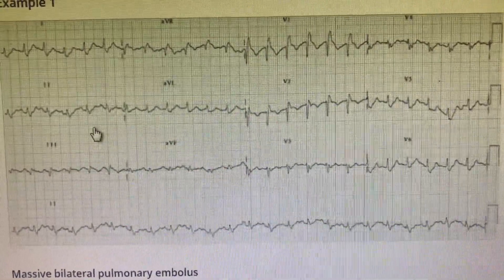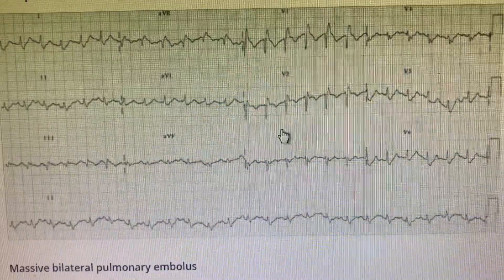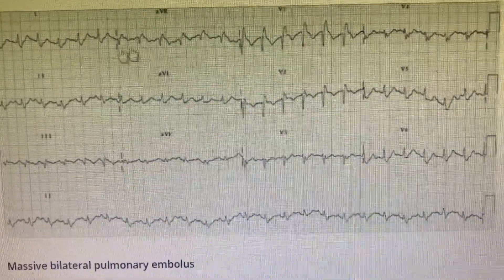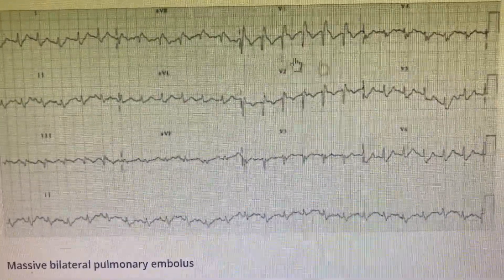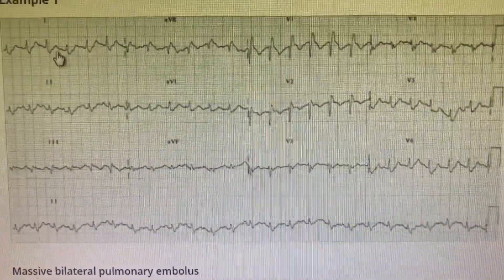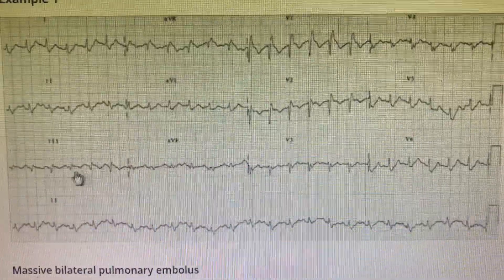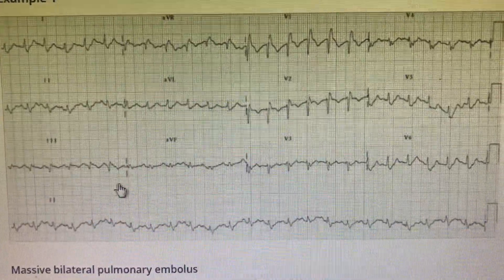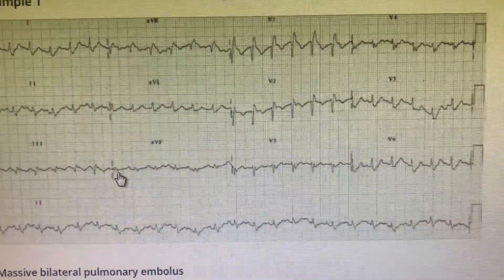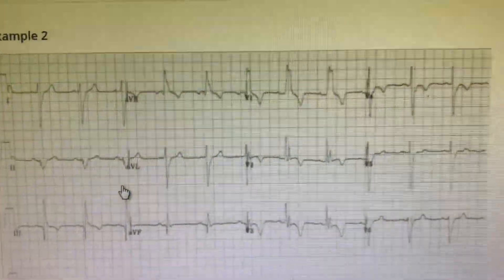This is a minor variant of S1Q3T3, but when taken in overall consideration — RV strain, tachycardia, low voltage complexes, poor progression of R waves, and an S1Q3T3 pattern — you should consider that it is a pulmonary embolism.